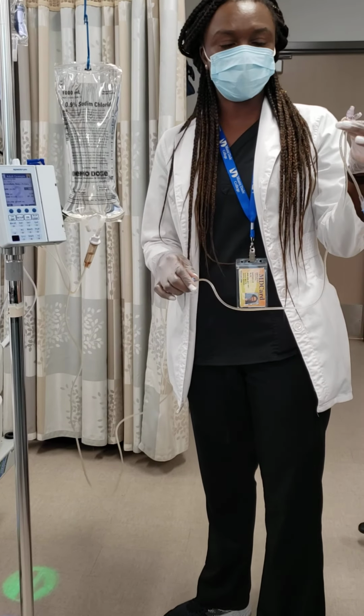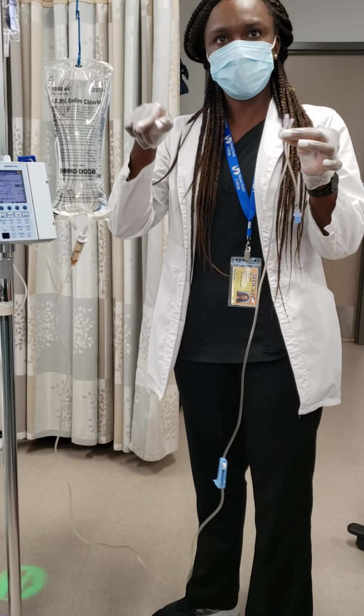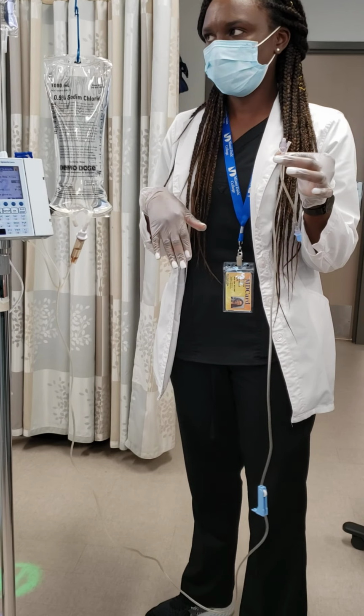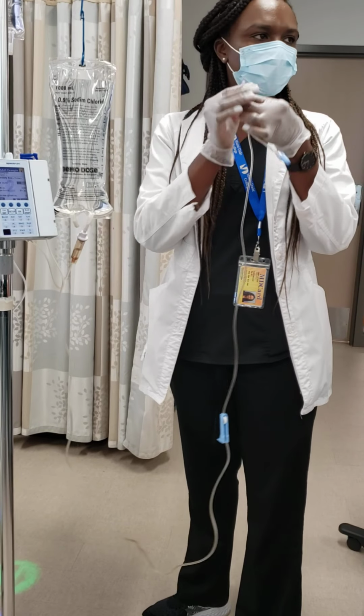That's okay, because if you don't do that, there are meds that can actually go up the line, and it'll take longer to be infused rather than pushed. Because if it's ordered pushed, it has to be pushed. All right. So yes, clamping is good.